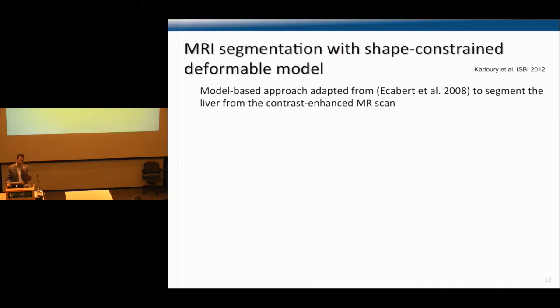If we look at the MR problem, so we have CT segmentation. It's only an intensity-based procedure. We usually have good resolution for those types of images. For MR, it's quite different. For abdominal scans, there's usually maybe 8 millimeters in space in between slices.